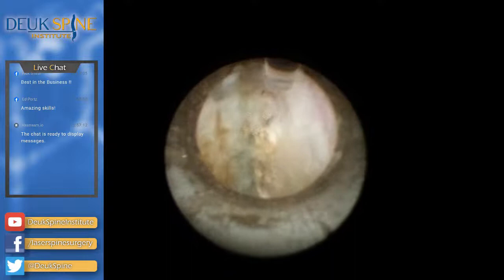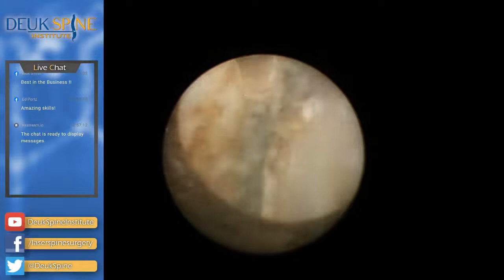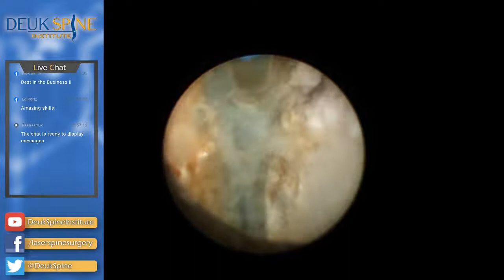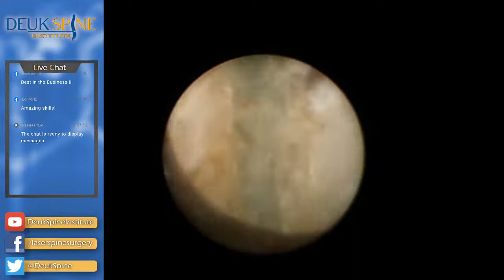All right. So you gotta be careful with these scopes. You don't wanna put a lot of stress on the scope itself, on the tube, because you'll actually fracture the glue that holds the fiber optic wires together, and then they'll become out of position and you'll get a blurry image, which you don't want. You'll basically have to repair the endoscope. But that said, if you had a rod lens, same thing. You can knock the lens out of position and you'll get a blurry image. So scopes are expensive to fix, thousands of dollars every time. So I try not to damage the scopes.